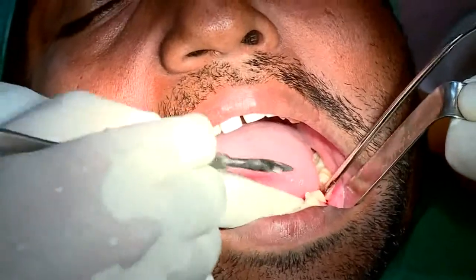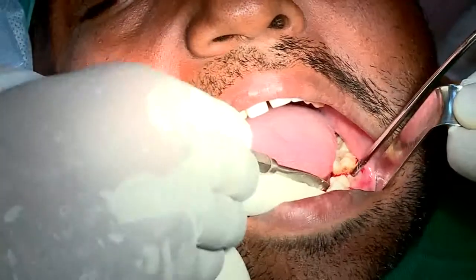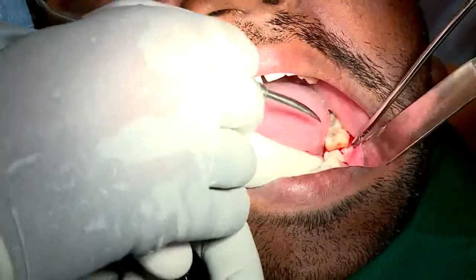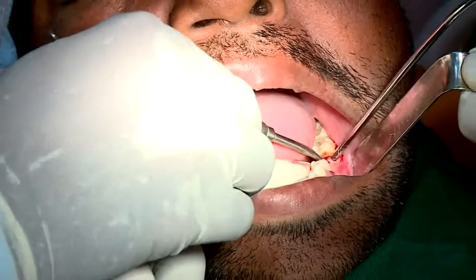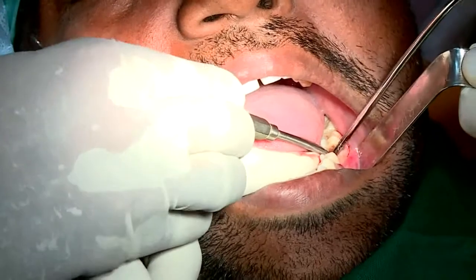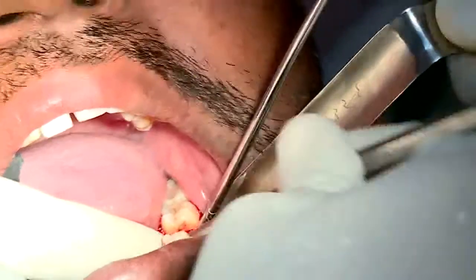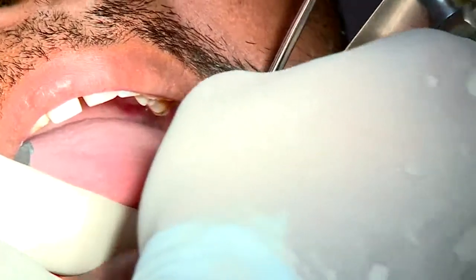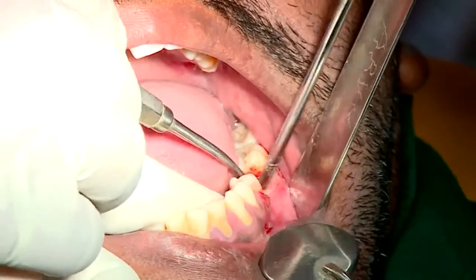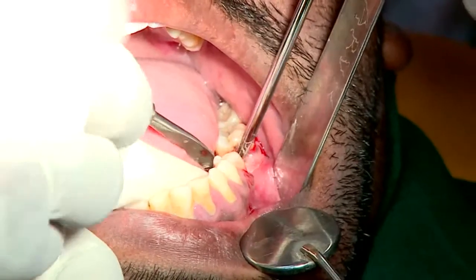Dr. Yasser, in the meanwhile, you could go ahead and explain to them about the various incisions. Yes. Sir is making a standard incision called a crestal incision, a connecting line along the center of the crest. But the problem is, once you go for extraction, in the healed socket the attached gingiva, the keratinized gingiva, is very minimal, and the muscle tends to come through the crest.